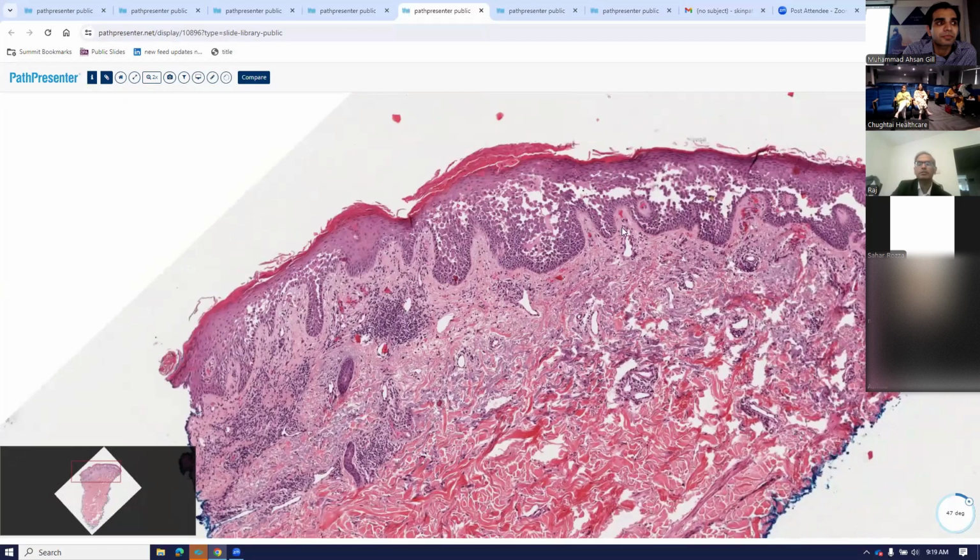Sometimes you can also see the split occurring suprabasally in Hailey disease. So you have to always remember, when you see something that looks like pemphigus vulgaris, the other differential diagnosis is always going to be Hailey disease. A couple of things: Hailey disease will never involve a follicle. Pemphigus vulgaris tends to involve a follicle. And if you do the immunofluorescence, you are going to see the intercellular IgG and C3 in pemphigus vulgaris, and you will see a negative immunofluorescence in Hailey disease.